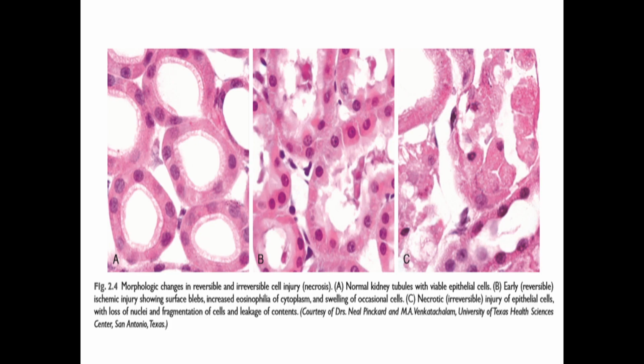C, necrotic. We reached the stage of necrosis, which is irreversible injury of epithelial cells with the loss of the nuclei, some of the nuclei lost from the cell, and the fragmentation of the cell and leakage of its content.